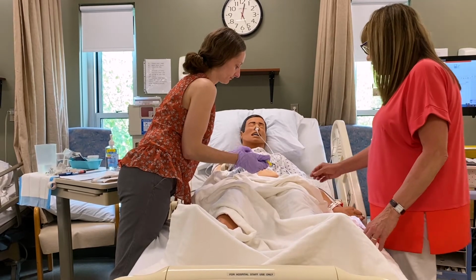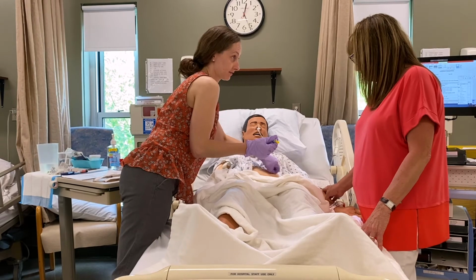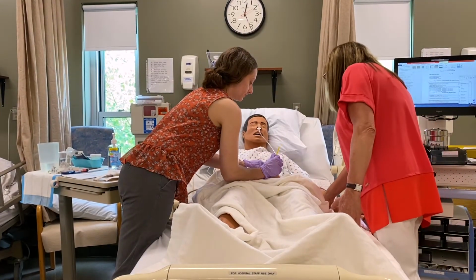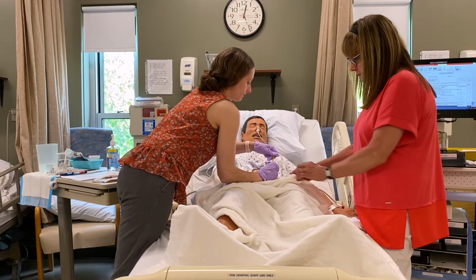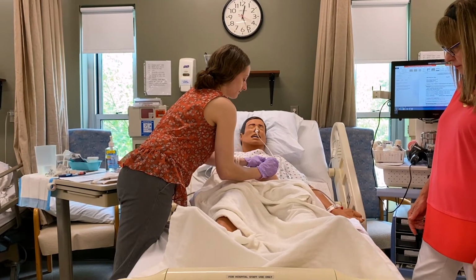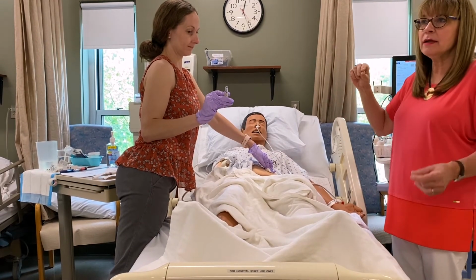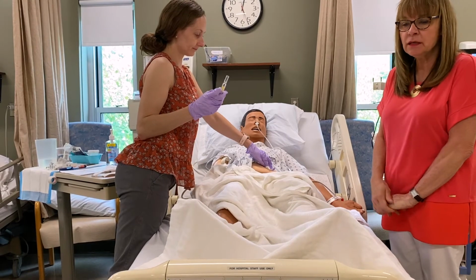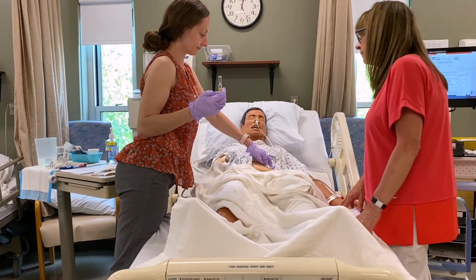And this medication is for? This is to help prevent his blood clots. Good. Yes. Notice he's got a VTE. Straight in. Straight in, 90 degrees. Two-handed technique. And gauze on the puncture wound. Pressure for 30 seconds to a minute to prevent the med from tracking up and causing a bruise.